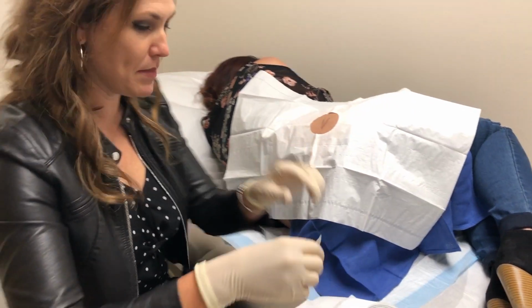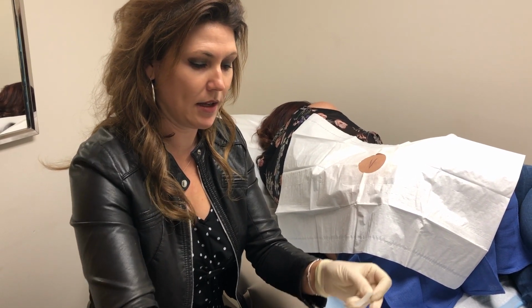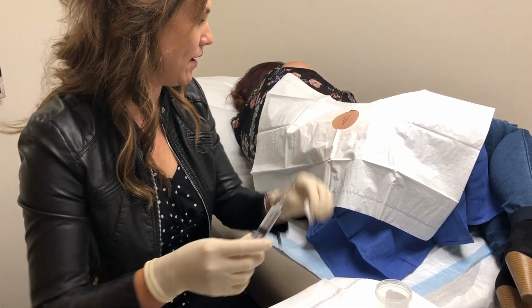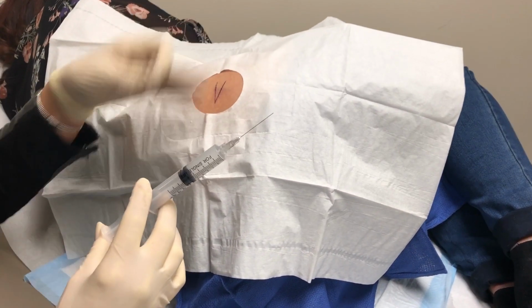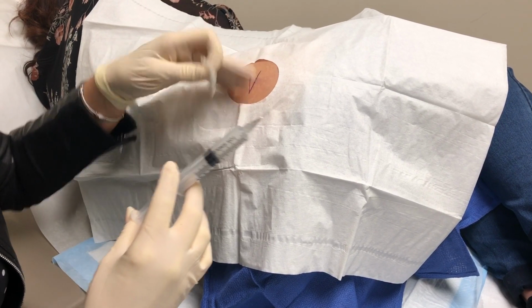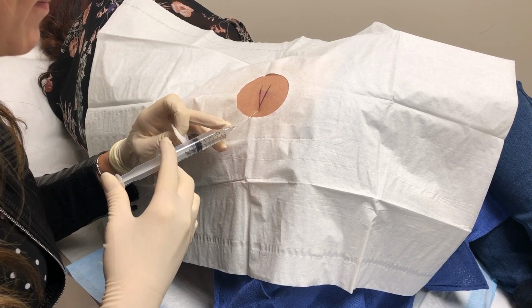And now we're gonna go ahead and just make a little wheel of numbing medication that we call lidocaine here at the base of that V. Doing okay, Lynn? Mm-hmm. You can feel a poke and a burn, okay? Poke.